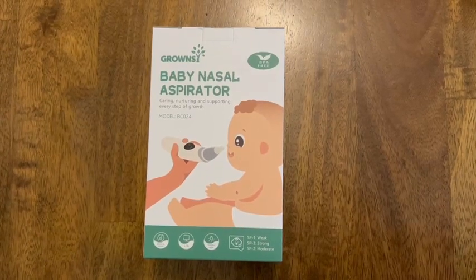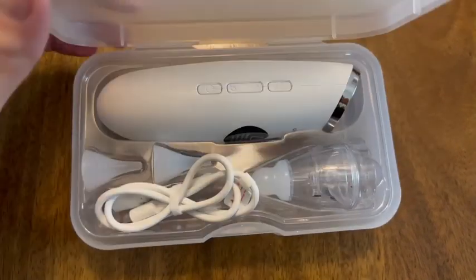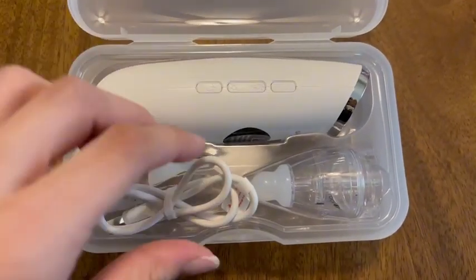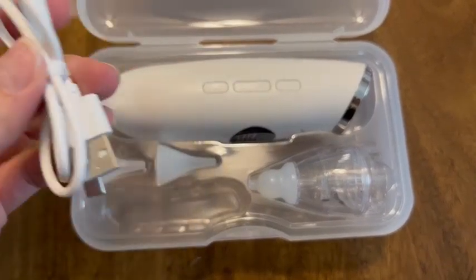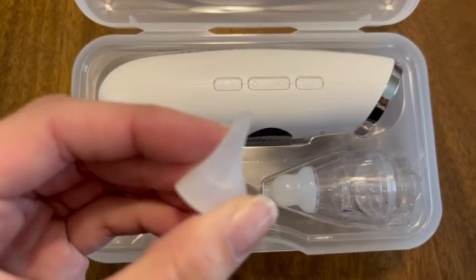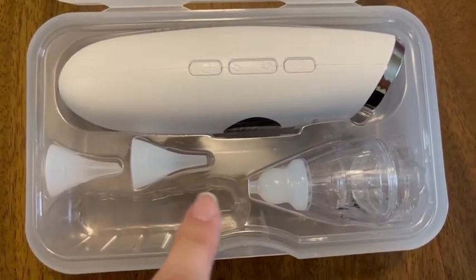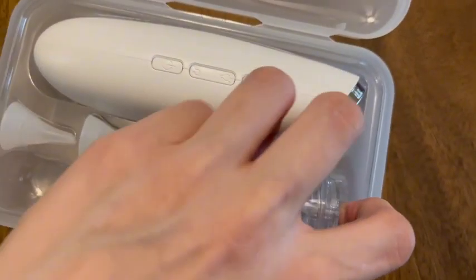I'm so excited to share my thoughts on this nasal aspirator for babies from Grownzy. For starters, it comes in this really nice carry set, so that makes for easy storage when you're not using it. You'll receive three of these silicone nozzles, and they are really soft, so you don't have to worry about them being rough against your baby's nose.